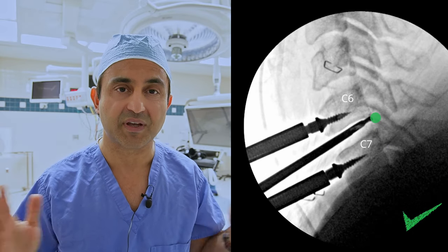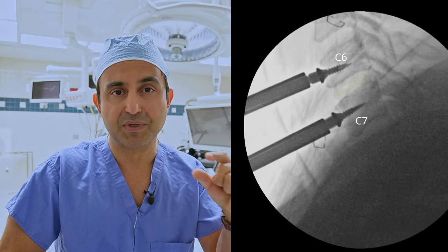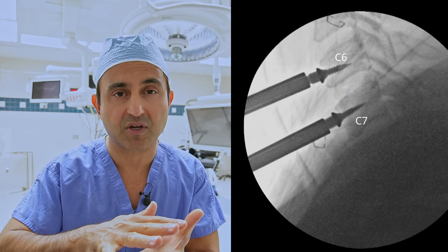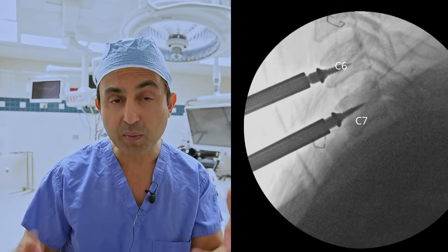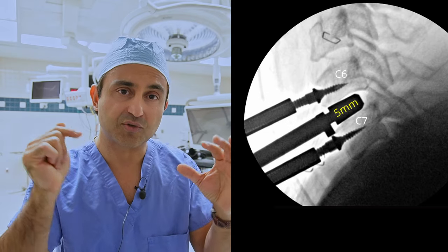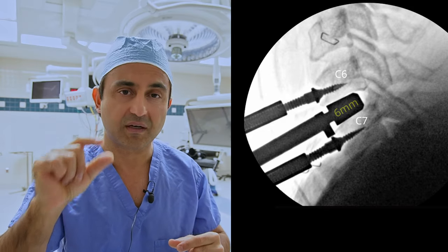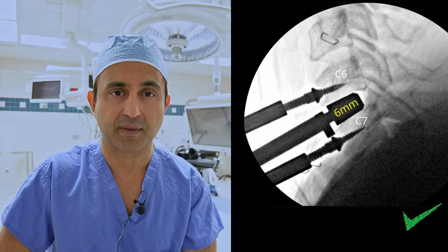At this point the C7 nerve has been freed up on both sides. You're now left with an empty space where the disc used to be, so you have to put a spacer in — otherwise the two levels are going to collapse — and it must be the correct size. We have a series of trial spacers that we put in sequentially to see how snug the fit is. When you find the correct fit, that is the size of spacer you need.